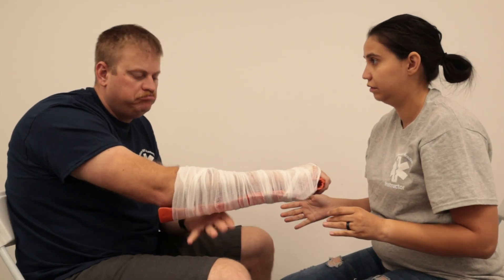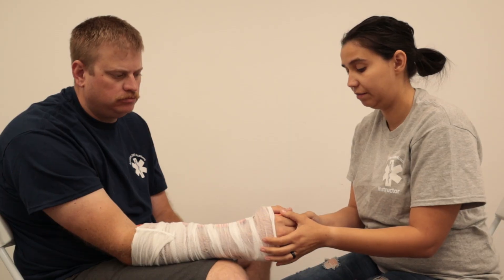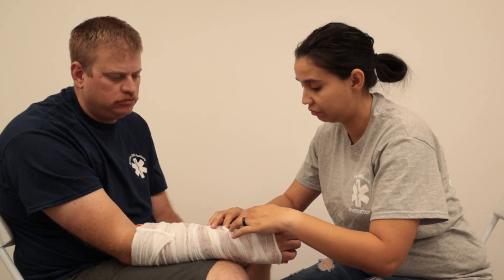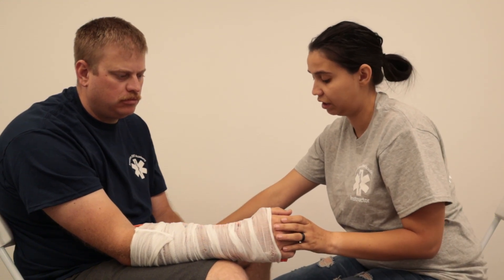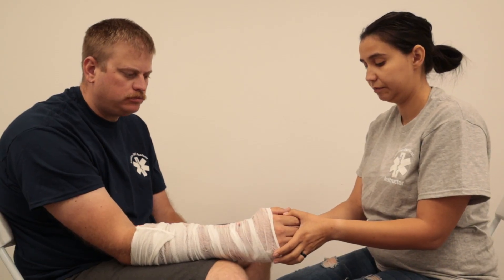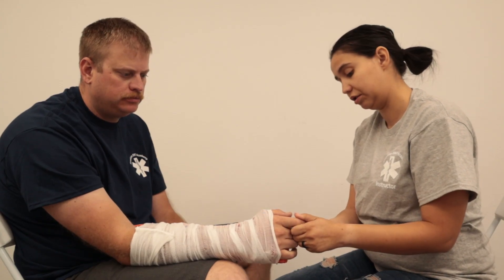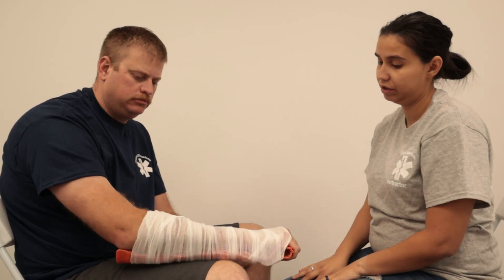Now that we're done, we're going to reassess all of our PMSCs. We're going to check for a pulse — sometimes you can get it through the wrap. I'll check circulation and the other hand as well. Motor skills: can you wiggle your fingers still? Perfect. Can you tell me what finger I'm holding? Pinky. Then I'll check the circulation one more time — and that is joint immobilization.